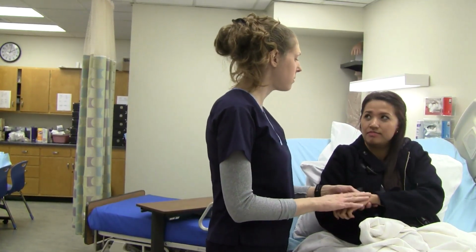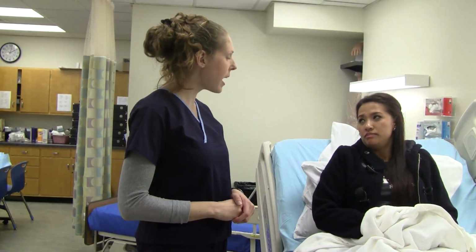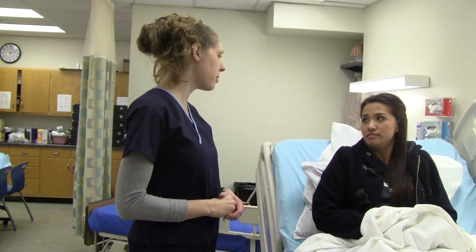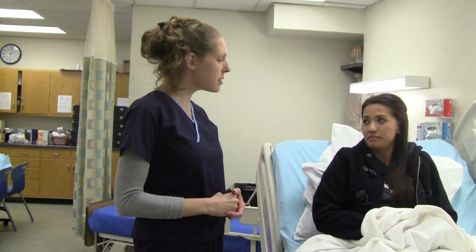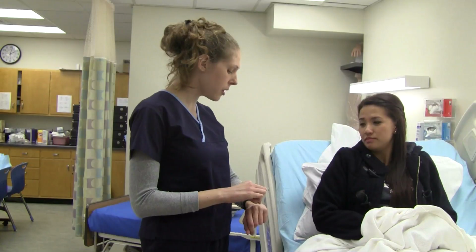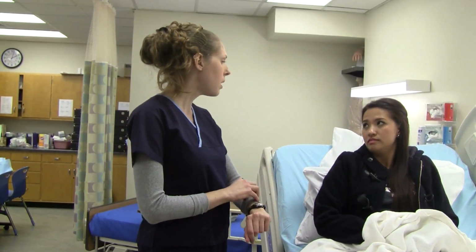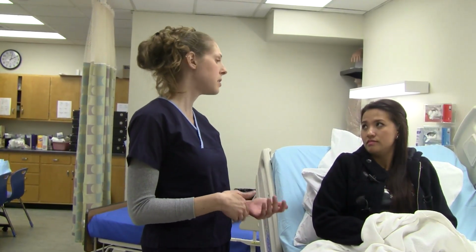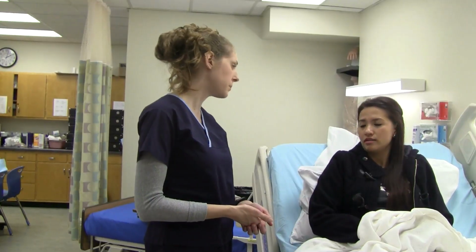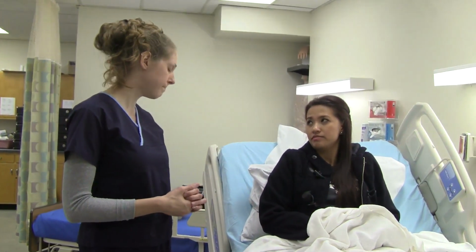It matches your... Explain the procedure to the patient and discuss how the results will be used. I have a new order from your doctor to start an IV. Do you know what that is? No. Okay, well that's where we put a catheter into one of your veins, either on your hand or up here on your forearm, so that we can give you medications through that without having to stick you over and over and over. Okay. Sounds good.